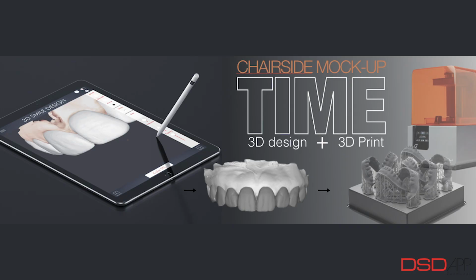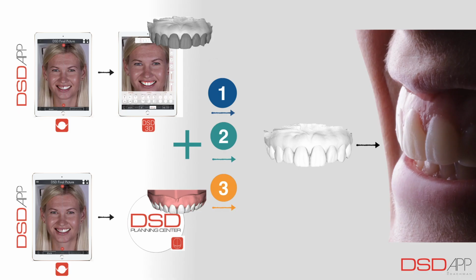In addition, the mock-up will serve as a blueprint for you to communicate to your lab what your final restorations should look like, and for the lab to use that information to manufacture your final restorations as you planned, and more importantly, as we promised our patients. This can only be achieved with the digital workflows and this digital technology.